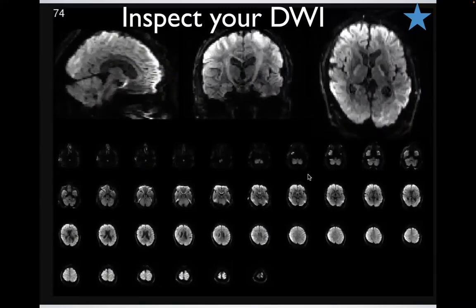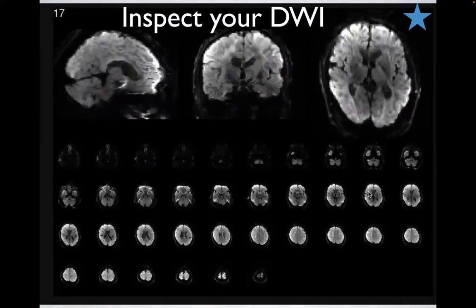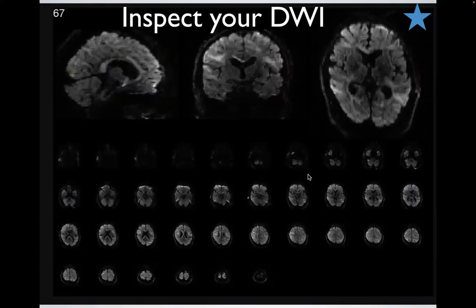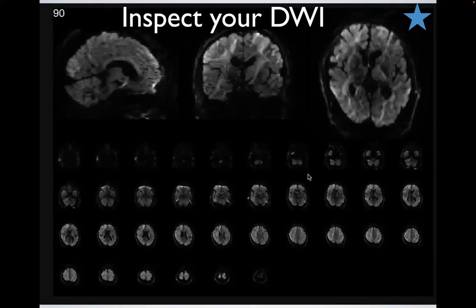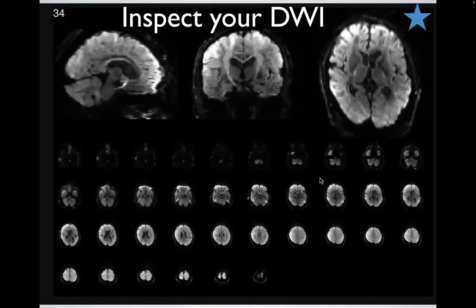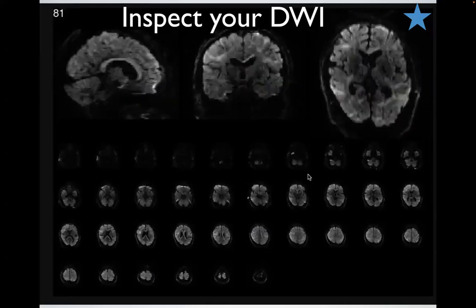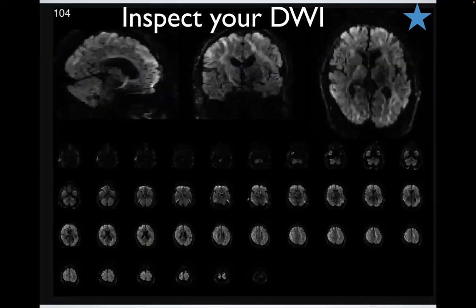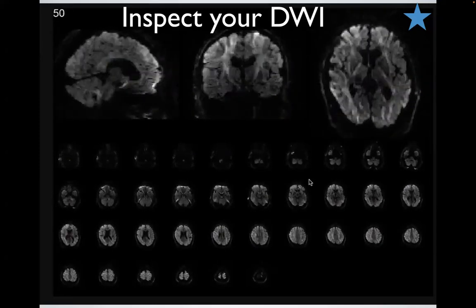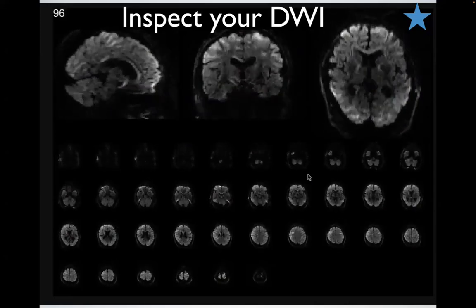Diffusion is like a movie in time, but it's not in time, it's in space. Remember the 3 images I showed you in X, Y, Z? Now I'm navigating across my 60 or so diffusion weighted images, or more, 100. What do we see here? It's striking. So it's about a 10-minute acquisition. We see movement, right? We see a bit of motion. It's impossible to stay still for 10 minutes in the machine. So you'll see an important part of the tractography pipeline is to correct for motion.